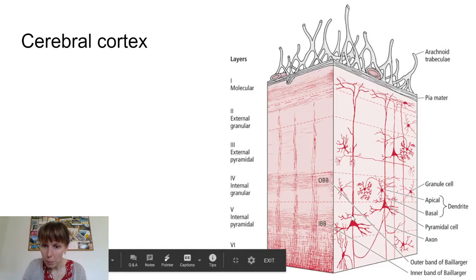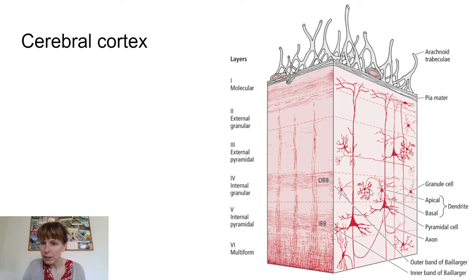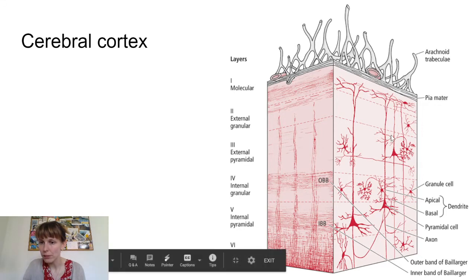These are the big pyramidal cells, and their axon will be going away from the cortex. Their dendrites will be very branched and sometimes very long, and they will also be reached by interneurons, which will be influencing what happens to the action potential if it gets sent into the axon.